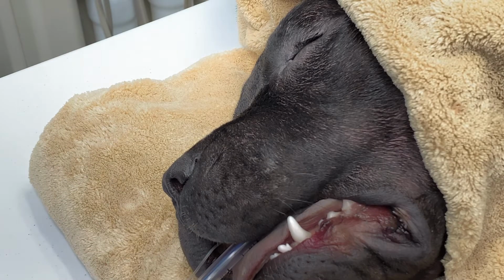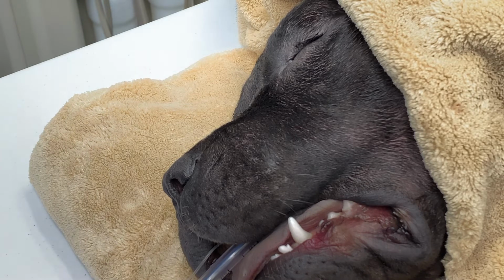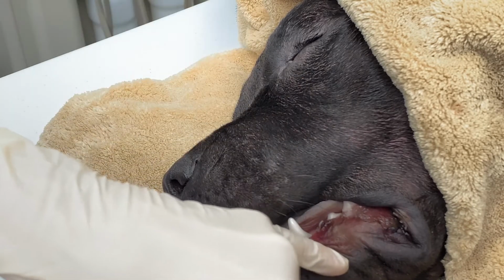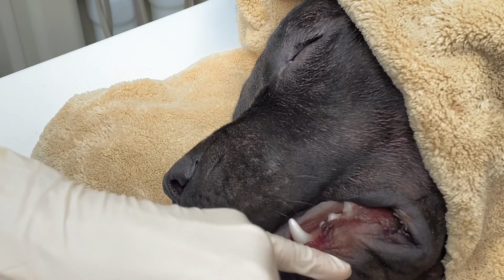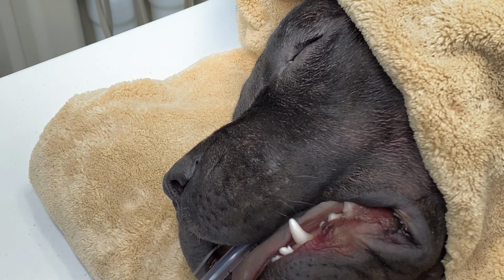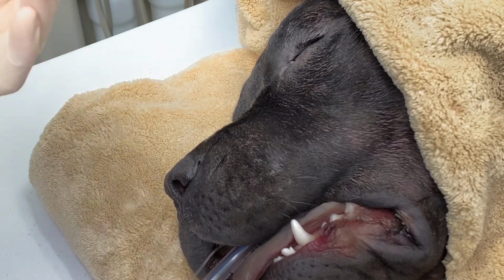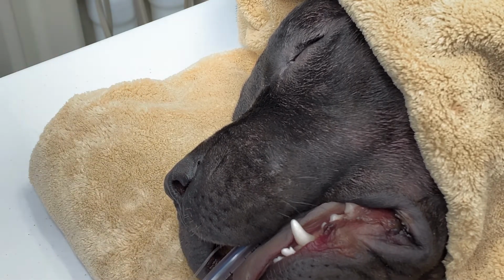So if you're acquiring images with the patient in lateral recumbency, whether you're doing the maxilla or the mandible, what you're going to do is place the sensor guard on the right side of the patient's mouth, and you're going to put it in between the upper fourth maxillary premolar and the mandibular first molar.